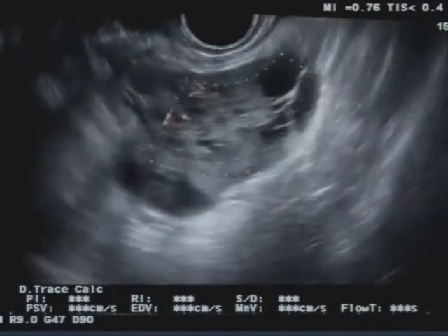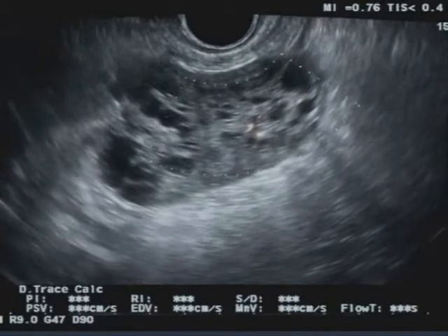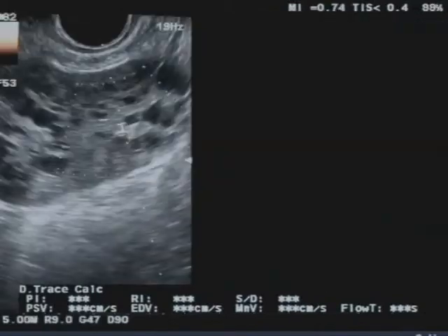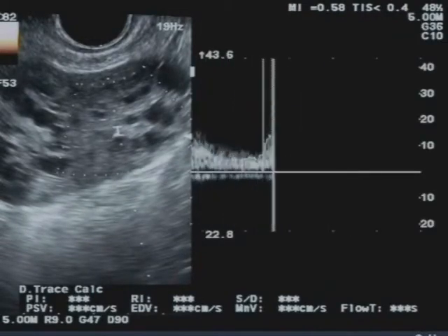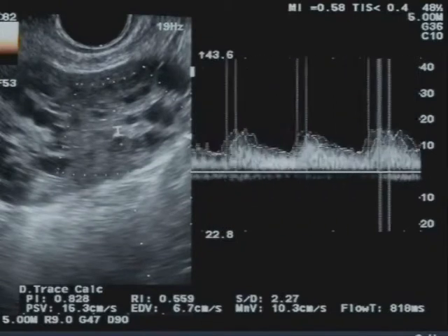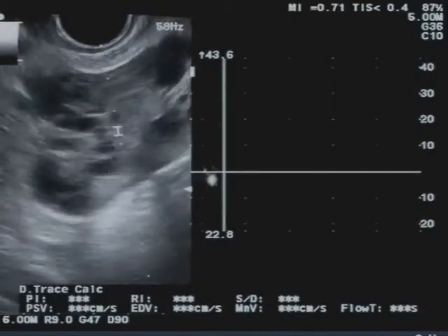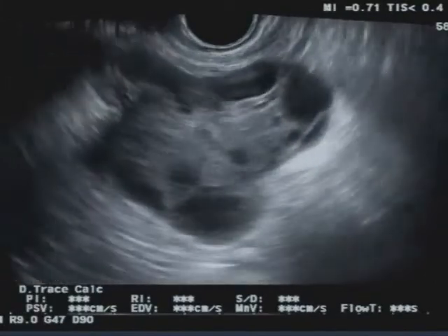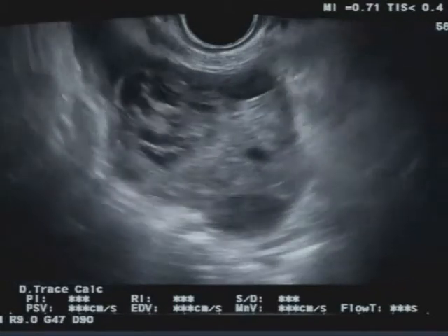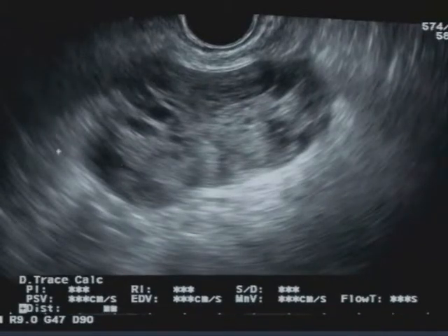In fact, the patient shows an exam performed about 10 years ago, which showed a regular left ovary, and all of this brings us to think that the mass had an ovarian origin. Also note the echostructure of this mass, with these cyst-like formations referable to ovarian stroma, because, having been examined, we observed no other structure referable to the left ovary.